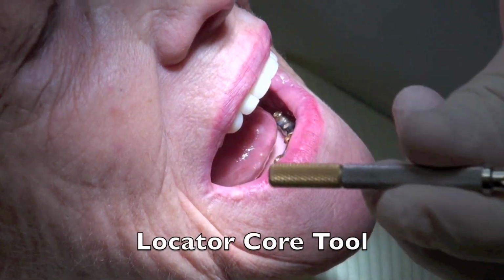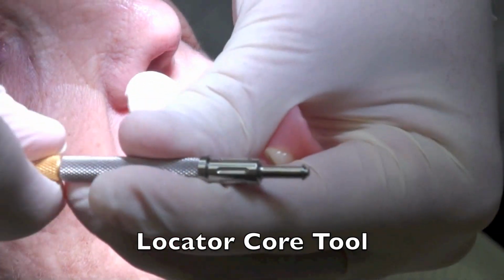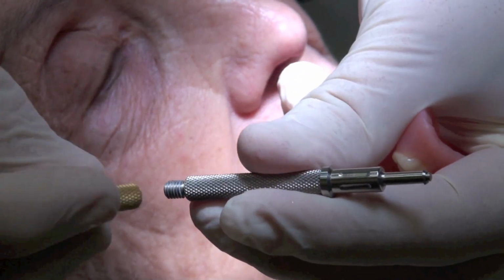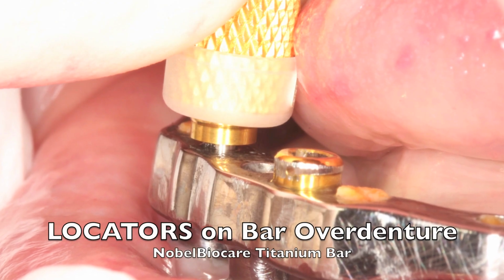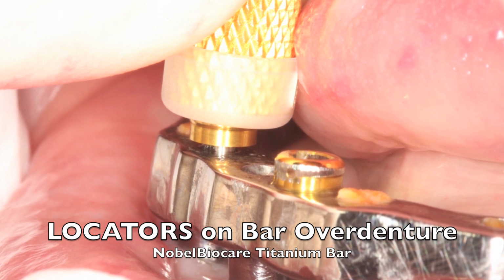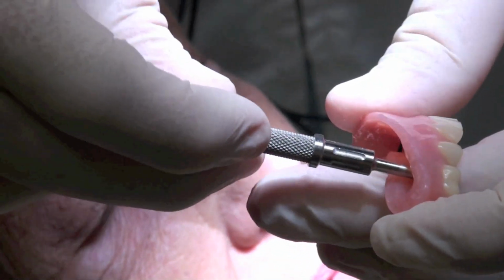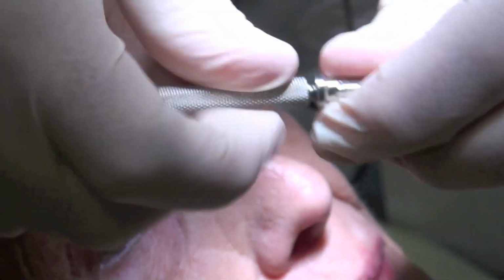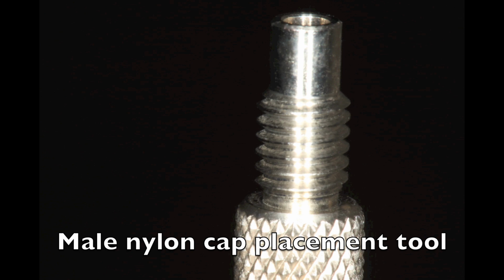So this is the core tool, and on the core tool you can see that it has 3 parts. There's a part on the end here that helps you to put the implants, the locators, on and off. There's a little part that attaches to the locator. So it's a smart little tool. Then we have the part that's going to take out the resilient cap, the male cap, out of here. So it's going to pull it out here. And we also have, if we unscrew this, the part that's going to put it in, right there. Okay, so it's smooth on the end, so it's the part that's going to put it in.